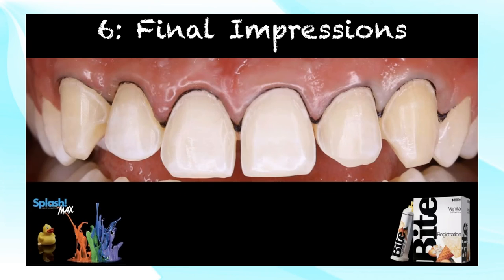So the final step is going to be the impressions. Taking a high quality impression is very important. So I use Splash Max for my impressions. It's a hydrophilic material. If we have a little bit of moisture, it's not a problem. You're still going to get a really, really good impression. And we also want to have a perfect bite registration.